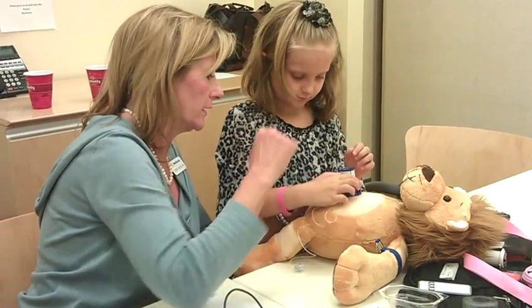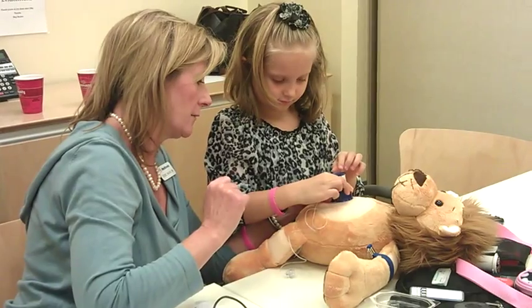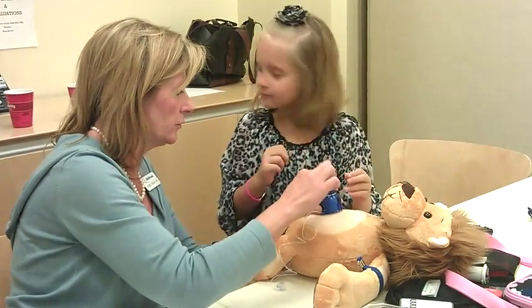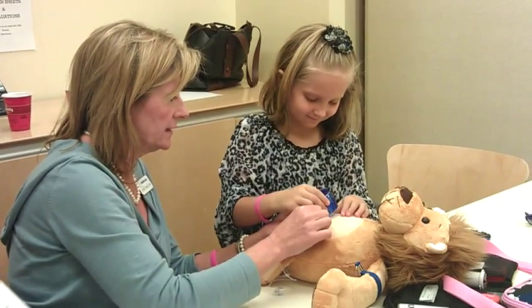Now I want you to take the — oh, you already know how to do it. That's exactly how mommy does it. Perfect. We're just going to push that. There we go. Then let's pull the blue thing off. Then we're going to pull the needle out. There we go.